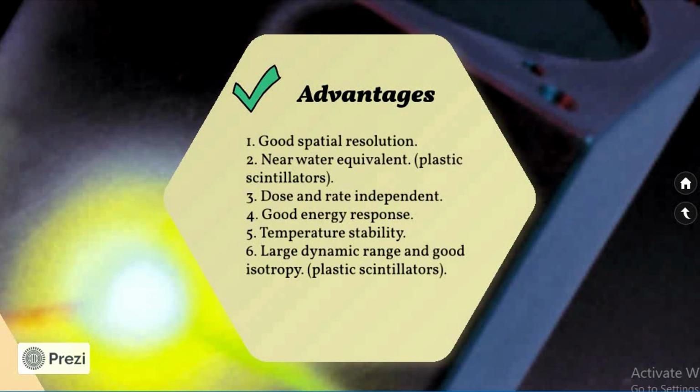Other properties of scintillators are good isotropy and a large dynamic range, which make them suitable for use in diverse radiation environments. Finally, small size. The typical small dimensions of scintillator dosimeters make them suitable for medical dosimetry in brachytherapy applications.